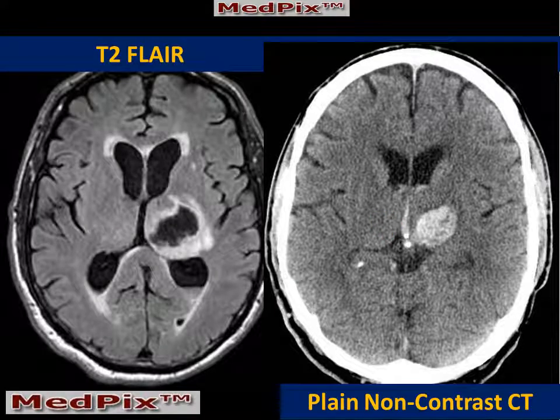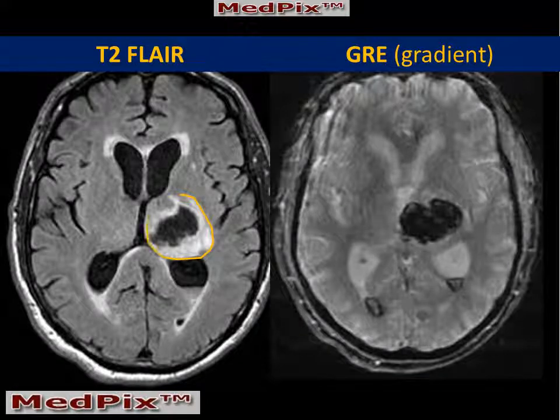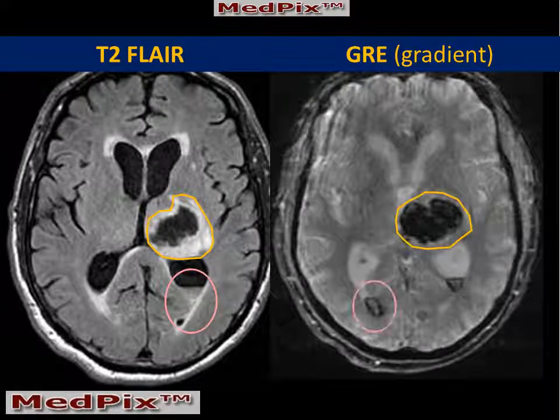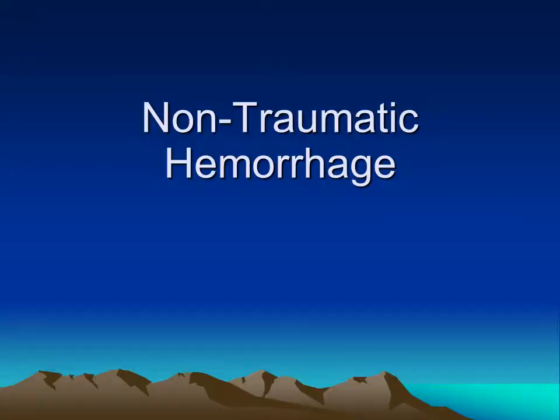The MR scan demonstrates a heterogeneous lesion in the left thalamus with an appearance consistent with acute hemorrhage. The gradient image confirms a susceptibility change due to acute hemorrhage, as well as blood identified within the dependent portions of both lateral ventricles. This patient has an appearance consistent with an acute, spontaneous, non-traumatic hematoma in the region of the basal ganglia and the posterior limb of the left internal capsule.